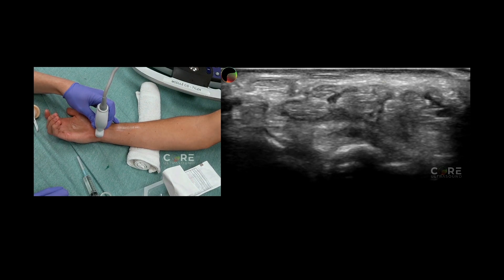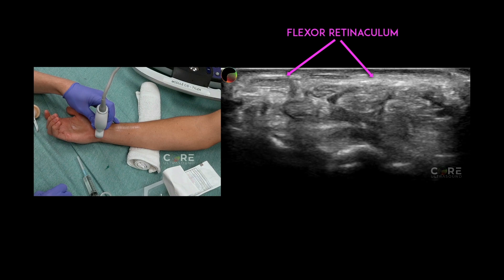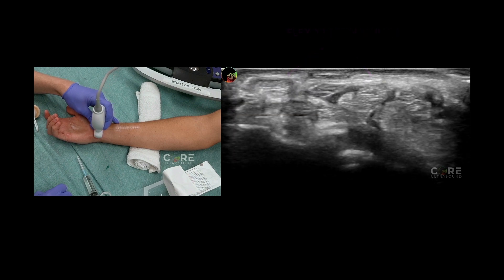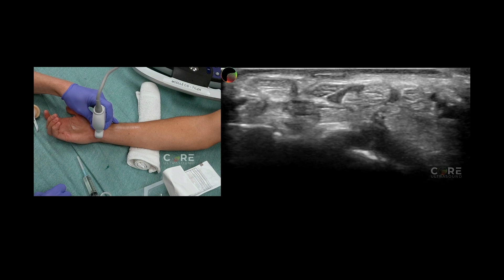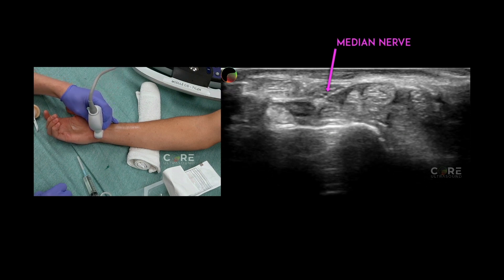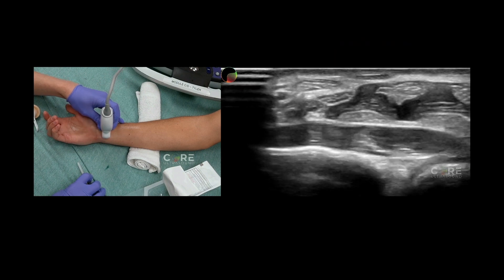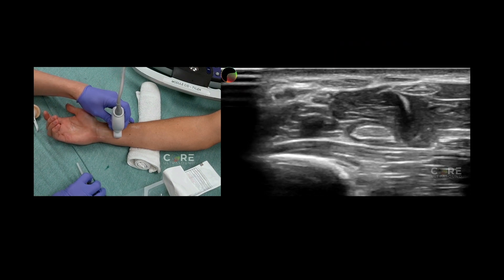We are going to be looking for the median nerve, which is just deep to the flexor retinaculum. We are going to use anisotropy to localize the nerve — we're going to fan the probe, and we see that the nerve in the center of the screen is not changing its color relative to the tendons. We can also follow it more proximally and see that it is not dissolving into muscles like the tendons do.